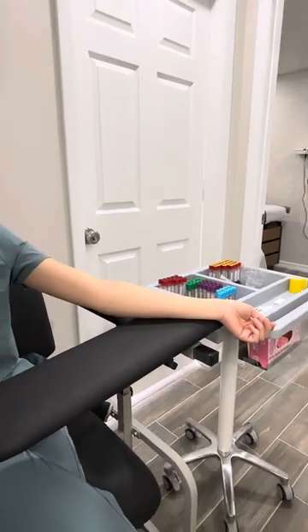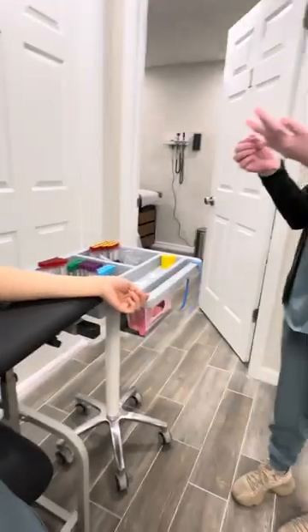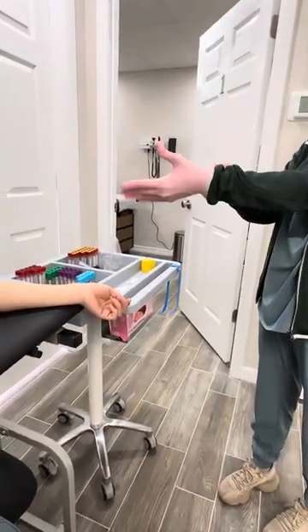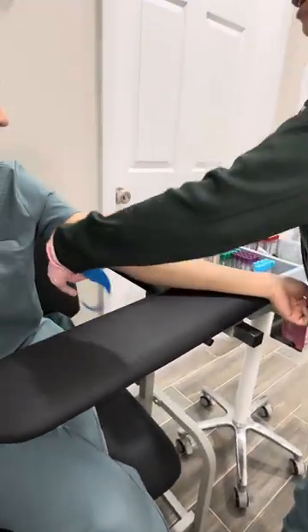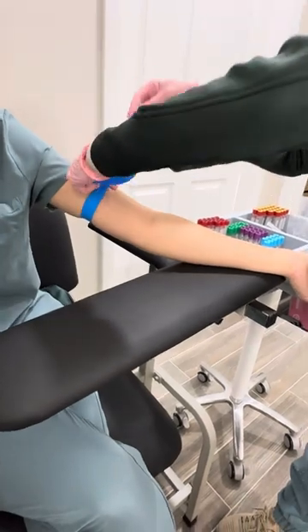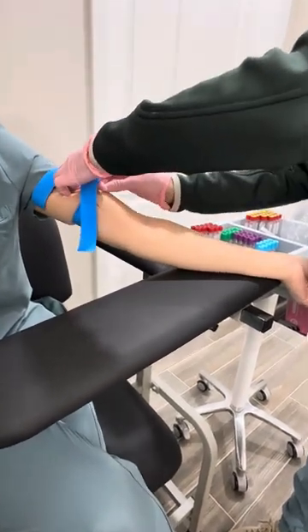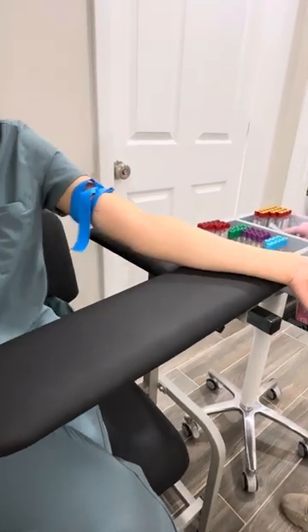You can tell what we're doing, Kayla. Gloving up. This is a venipuncture collection for some labs and we're just demonstrating how to do that for those who are learning.